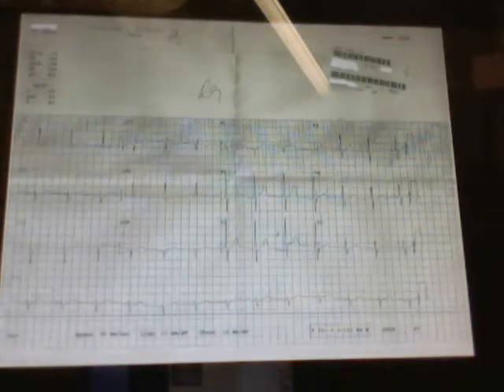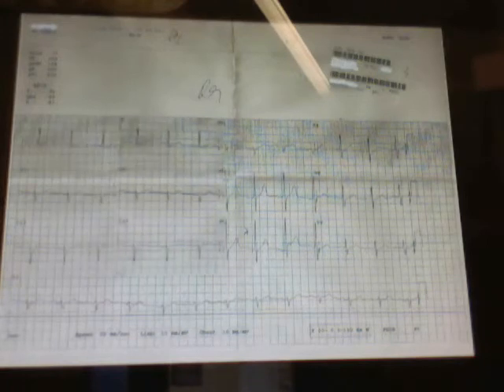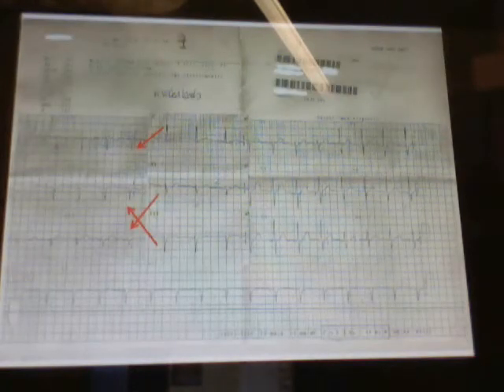So how about the limb leads? Again, we look at the correct EKG and pick up lead 1, lead 2, and lead 3 and compare with the first line. So look, the lead 3 EKG is now appearing in the lead 2 channel, and the lead 2 EKG is now appearing in the lead 3 channel, because the positive and negative have not changed. So everything is in the right pattern. However, lead 1 is very different. The lead 1 channel still shows the lead 1 EKG, but everything has turned upside down. The P wave has turned upside down, the R wave becomes a Q wave, and the S wave now becomes an R prime wave.